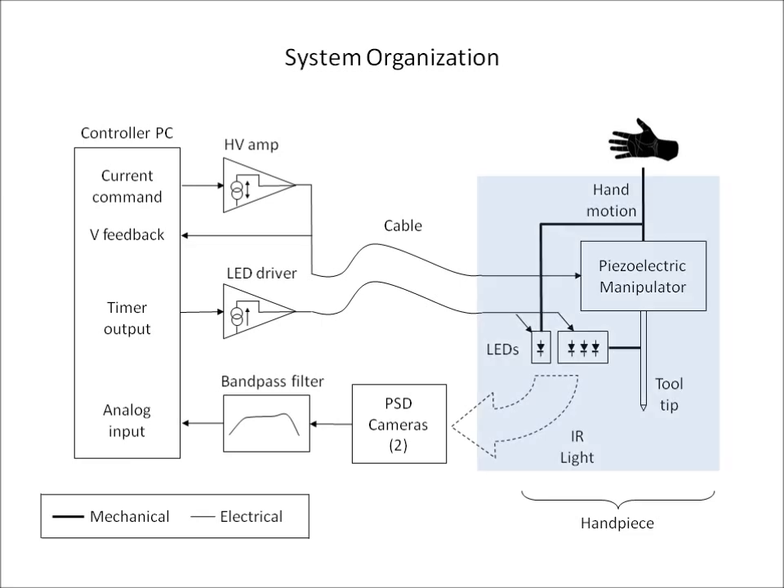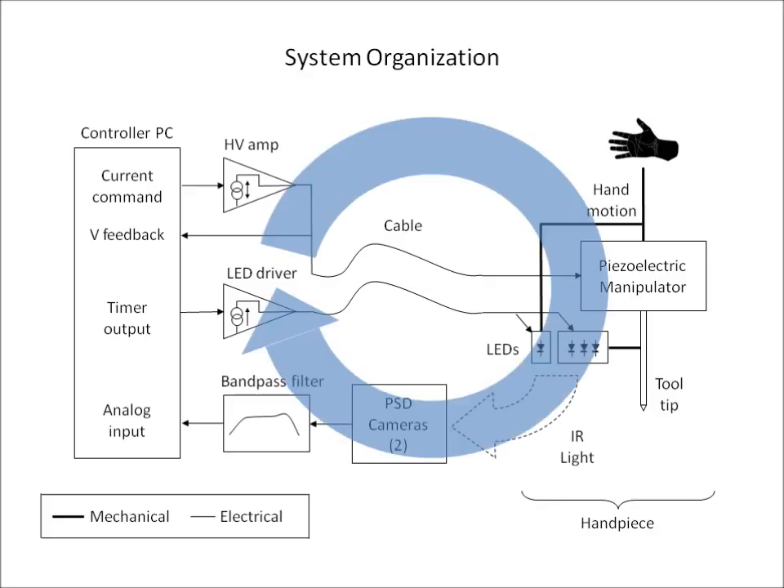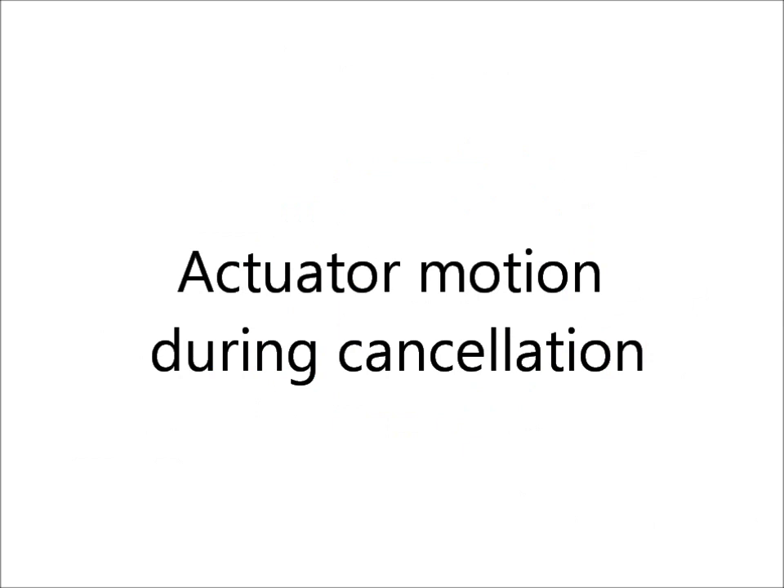The handpiece contains a piezoelectric actuator that can move the tip in three degrees of freedom, and infrared LEDs that are optically tracked to measure the six degree of freedom motion of the tip and handle. This position feedback is used to control the actuator so as to cancel undesired tip motion, creating the effect of the tip being fixed to a point in space while the handle is free to move. This can be seen most clearly by observing the actuator motion during cancellation.